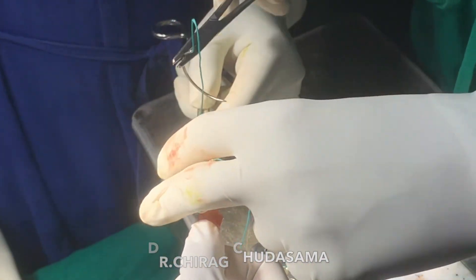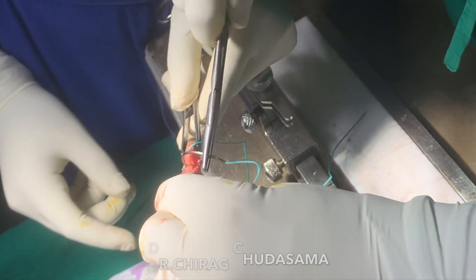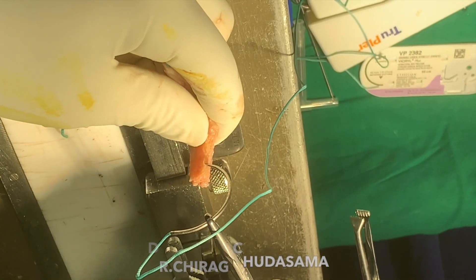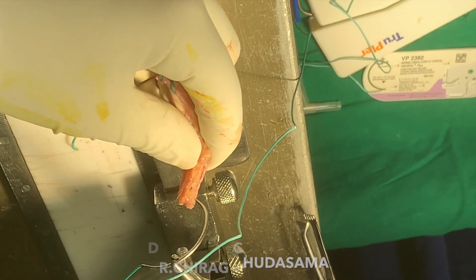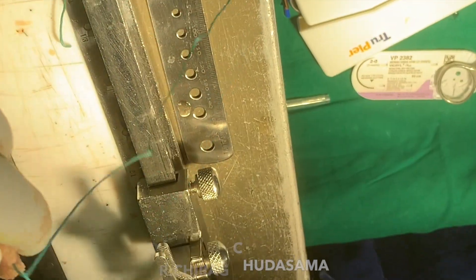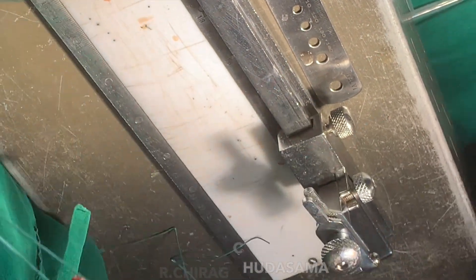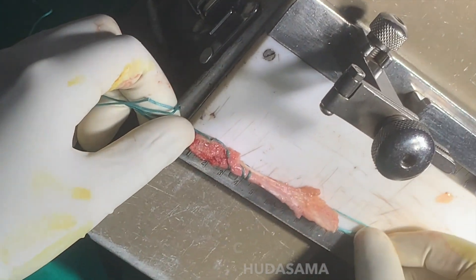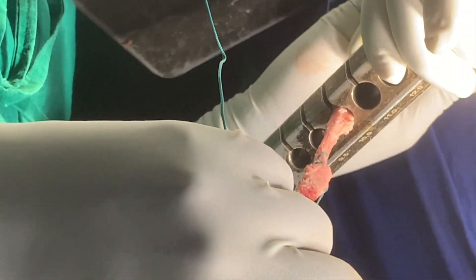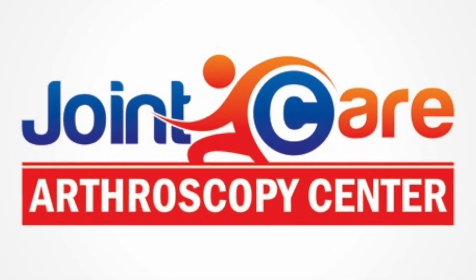Normally I use bias screws on both femoral and tibial sides. But in certain cases, like in PCL reconstruction when I am using the BTB graft, I will use suspensory fixation on the tibial side. This is how you prepare the tibial and femoral portion of the graft — the patellar bone block goes towards the femur and the tibial bone block goes towards the tibia. The graft length is almost 8.5 centimeters, and it goes smoothly and snugly through a 10 millimeter diameter graft sizer. Thank you.